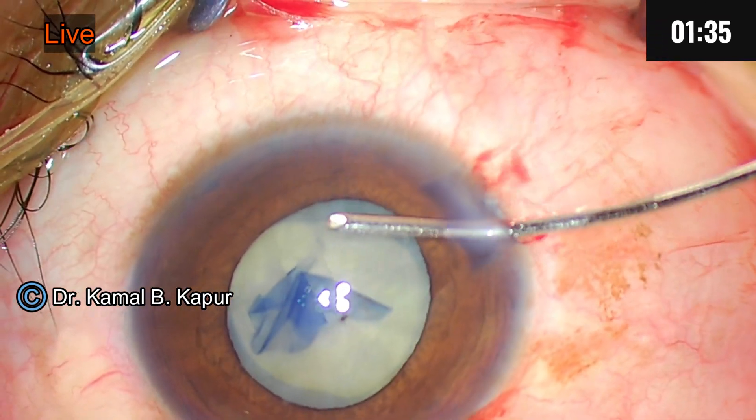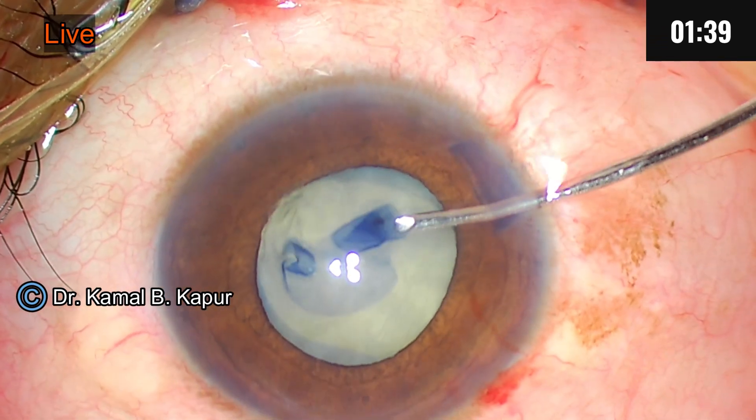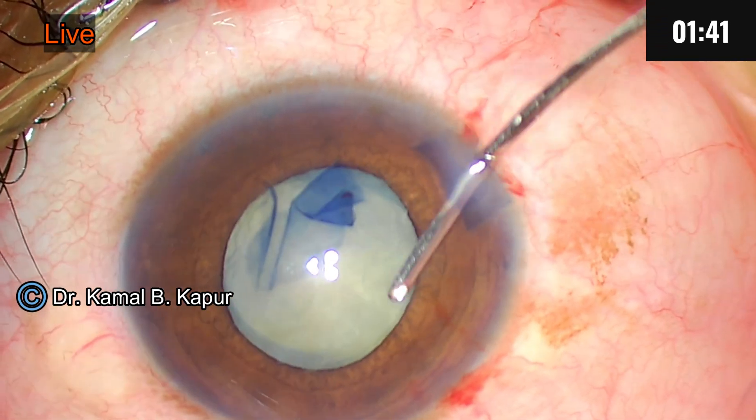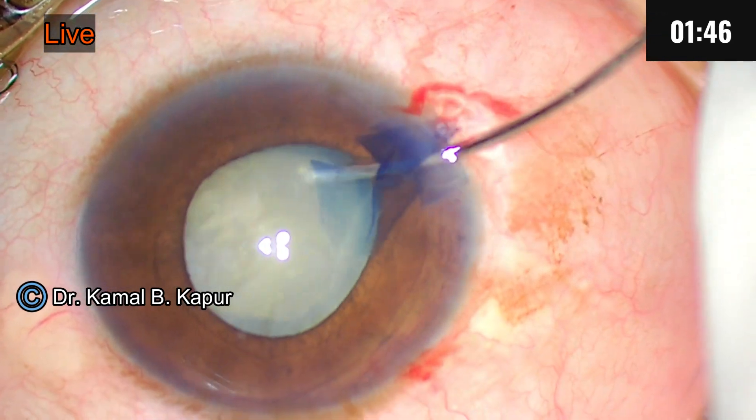Whenever you see a very shallow chamber, it's a very good idea to do a peripheral iridotomy beforehand. Otherwise, once you dilate the patient on the day of surgery, things will go out of control.